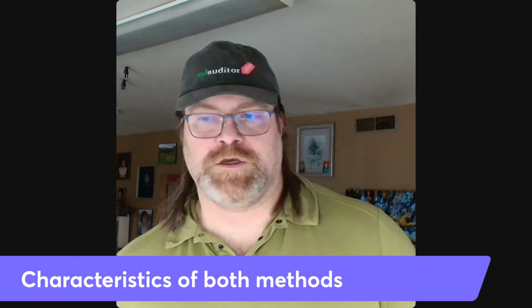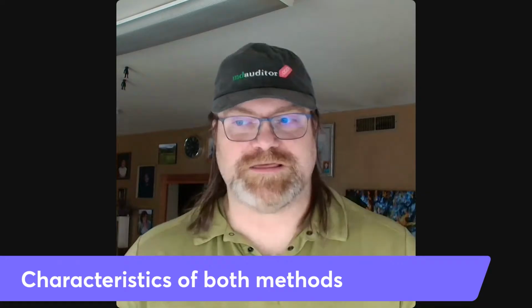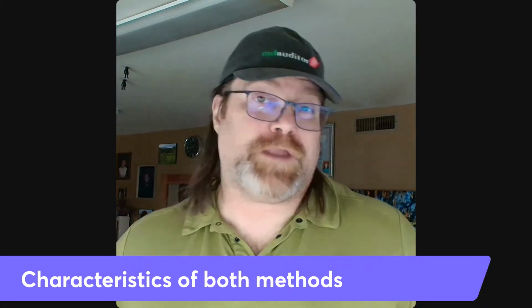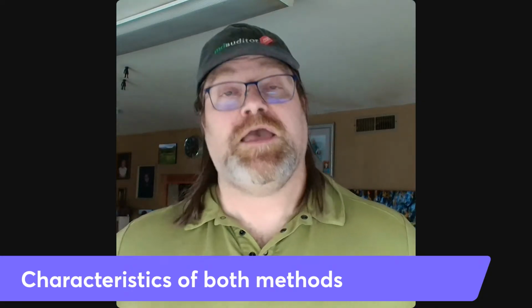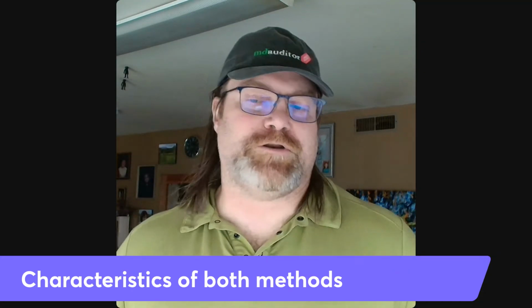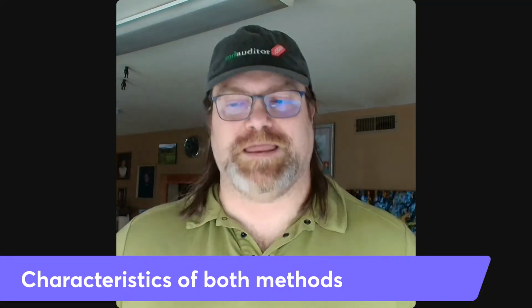characteristics of both methods. And they're almost exactly opposite of one another. So as I go through this, you're going to hear almost exact opposite things. Waterfall is linear. Agile, cyclical, and iterative. Now, in reality, you're probably doing iterative development no matter what until you get to the testing phase, and then it's probably a little bit more linear unless you fail a test, and now we're back to cyclical again. So waterfall is linear, agile is cyclical and iterative, but truth of the matter is your development's probably very cyclical and iterative, and then the regulatory review process is very linear.